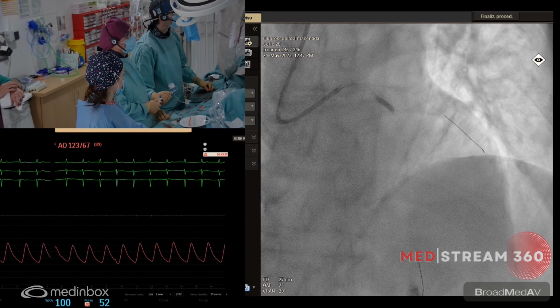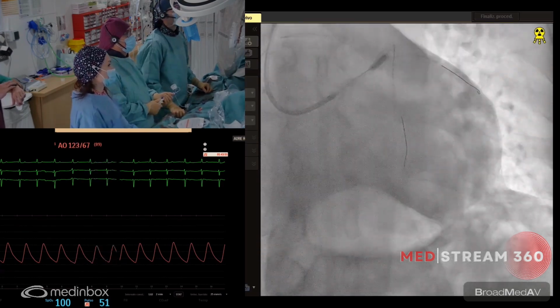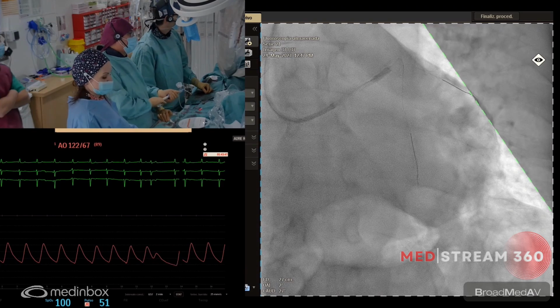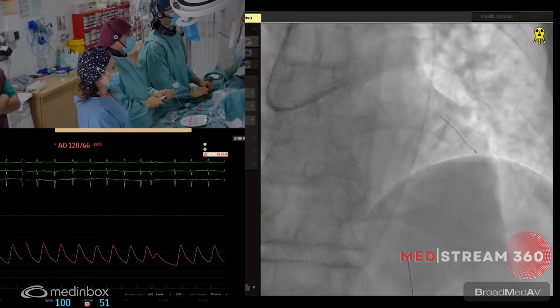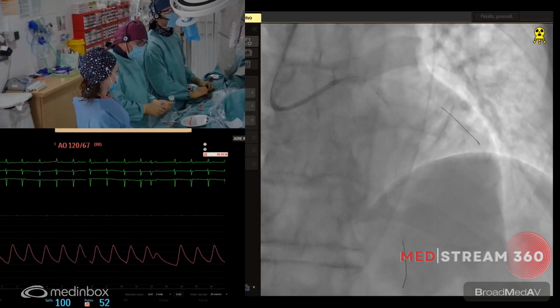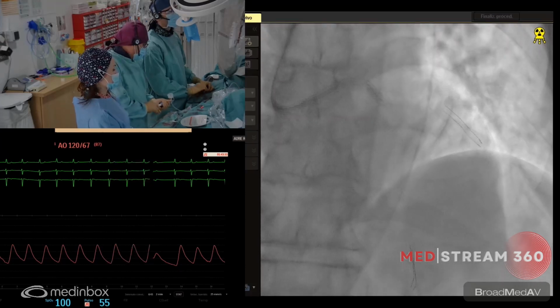Okay, this is the distal portion. 18. Hopefully the third diagonal maintains open. The expansion is quite good down. It's important to see this expansion in orthogonal projections. Sometimes you have some surprises. Very good. I think it was the most tight lesion, the tightest lesion here.